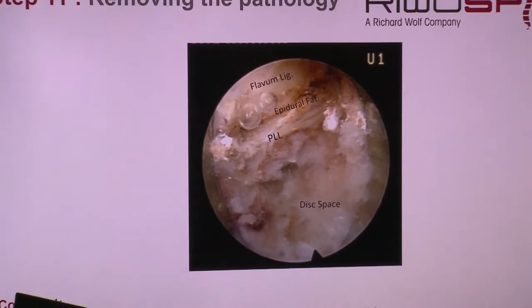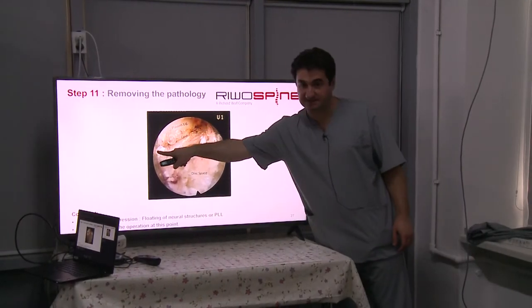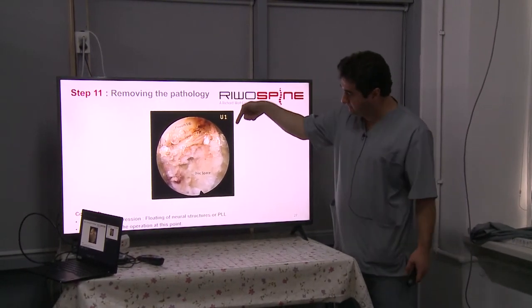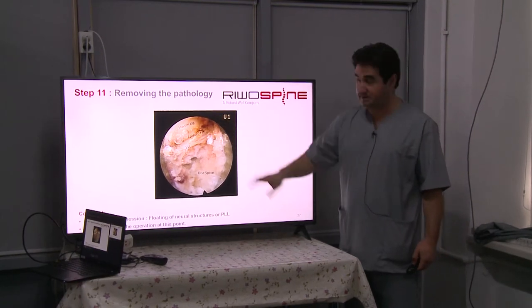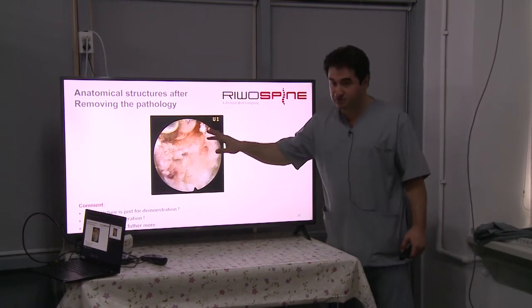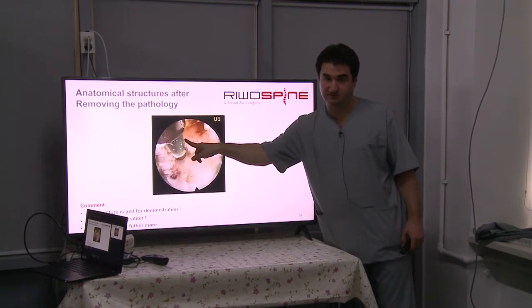Yep, you don't see it. The root is behind the fat tissue here, the traversing nerve root. Then the exiting nerve root, we already passed it. We are inside the spinal canal now. But to see the nerve root here, you have to dissect the fat tissue.